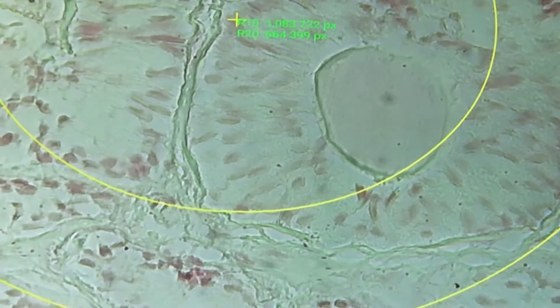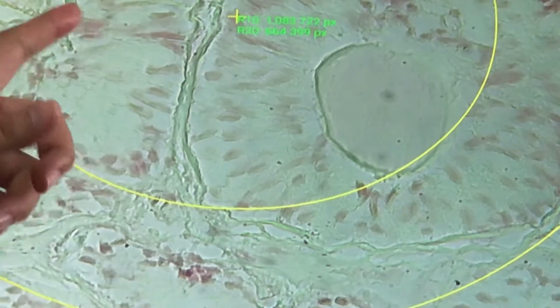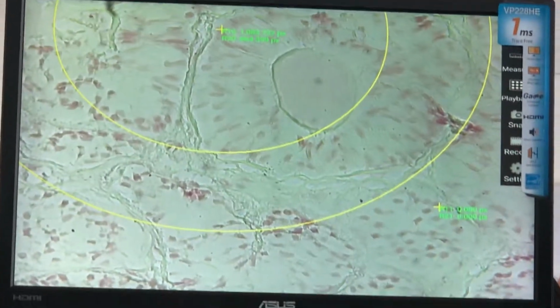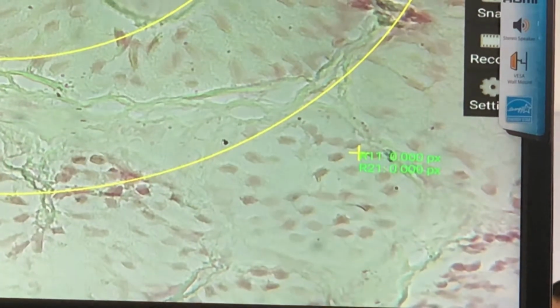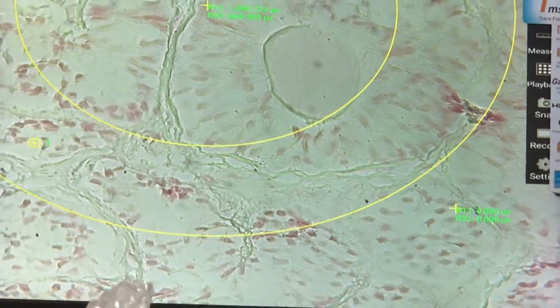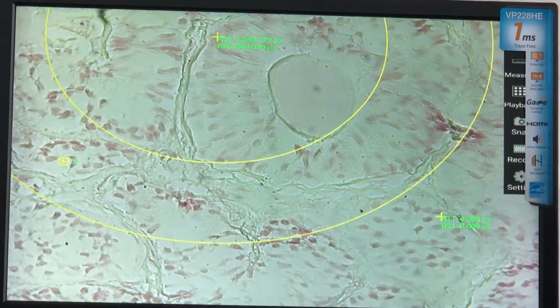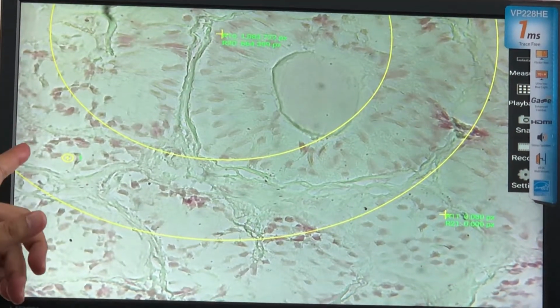You might note here in some area, hyperplasia of the interstitial cell of Leydig is noted. When I point here, I could see one hyperplasia. However, I don't know if it is the accurate one, because this slide is unfortunately photobleached. This is the one. Hyperplasia of the interstitial Leydig cell. Now, you know Leydig cells form a single layer of cells like that. But here, you see how many pale nuclei there are, plenty of layers of nuclei. So that is the interstitial cell of Leydig.